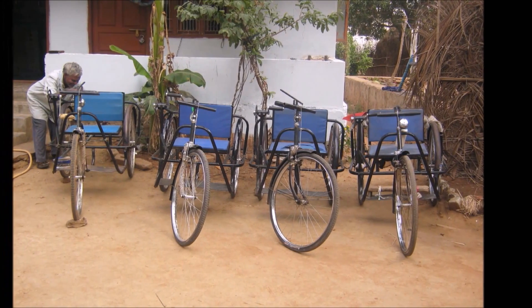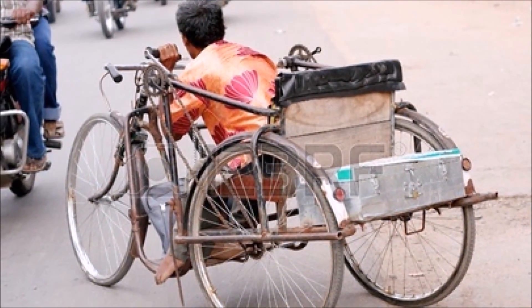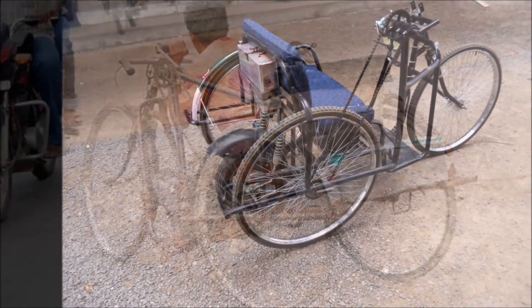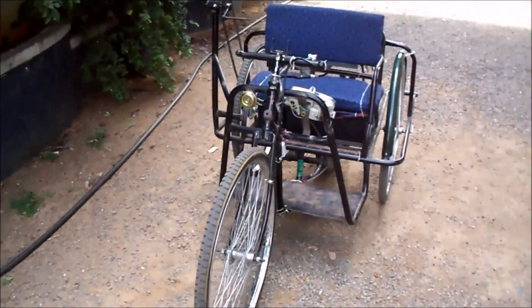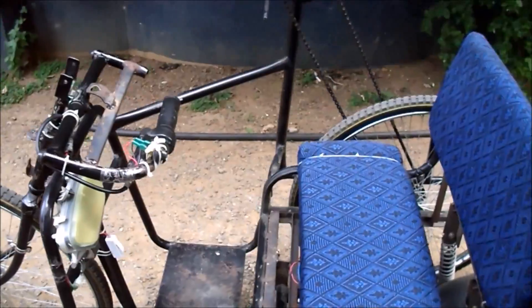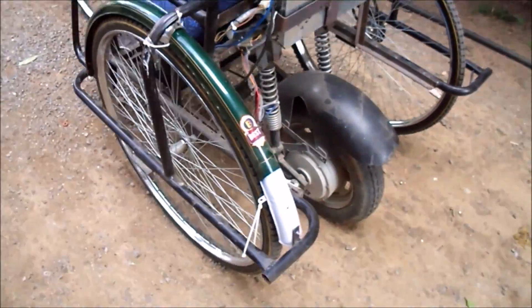Tricycle is the only option for physically challenged people. The life of these people depends on others in order to move from one place to another. To make them independent, these tricycles have been invented. However, the physically challenged people have to drive their entire weight by sitting on the tricycle with a single hand — this is quite difficult. We have seen the problem of these people and thought why physically challenged people can't have a motor-driven vehicle.